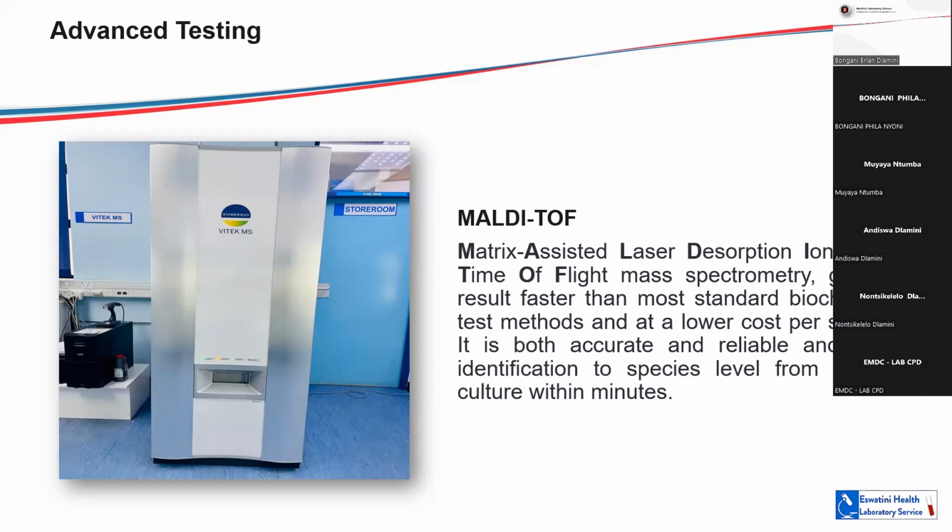It's referred to as a MALDI-TOF. So basically the MALDI-TOF is the principle of the analyzer, but the manufacturer is bioMérieux for this one, and it's called the VITEK MS, but it uses the MALDI-TOF principle. So the MALDI-TOF stands for matrix assisted laser desorption ionization time of flight mass spectrometry.